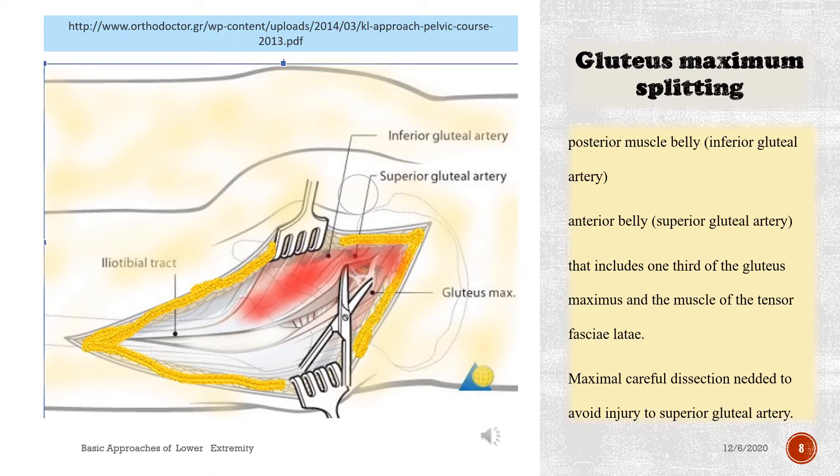Gluteus maximus splitting: posterior muscle belly and anterior belly that includes one-third of the gluteus maximus and the muscle of the tensor fasciae latae. Maximal careful dissection to avoid injury to the superior gluteal artery.